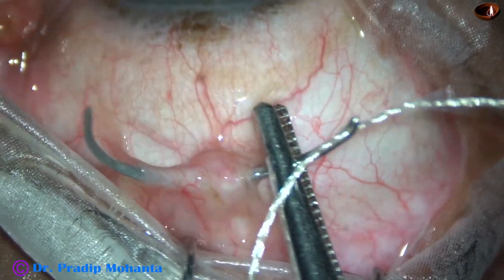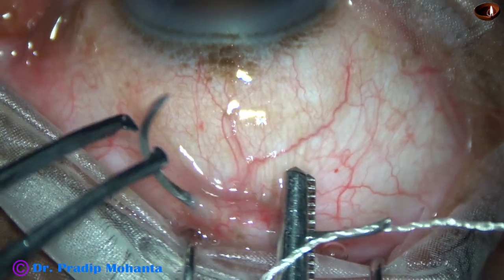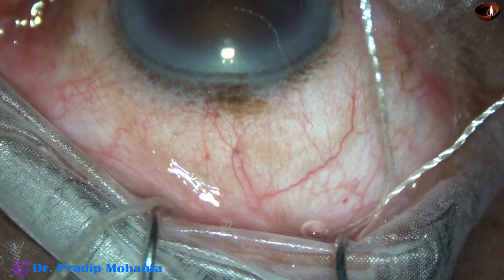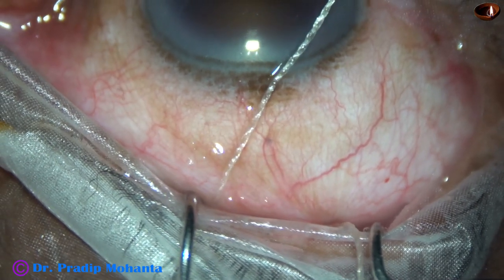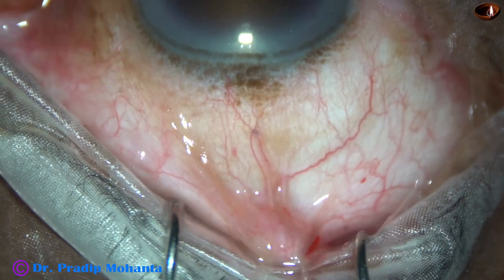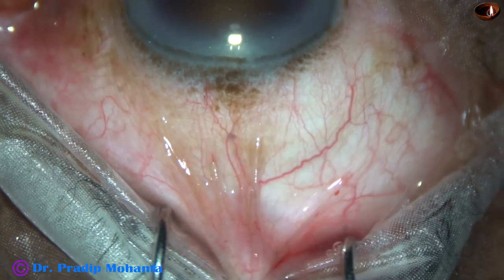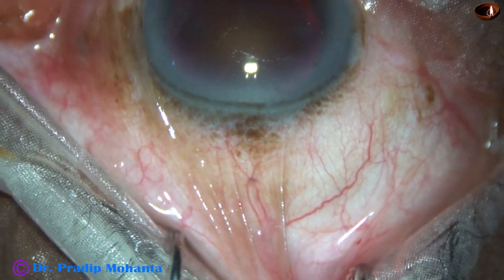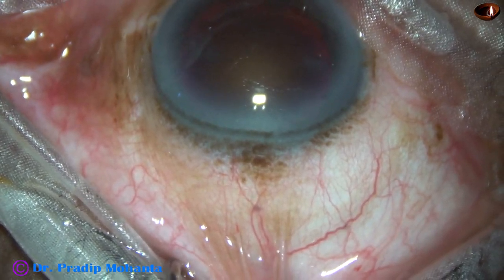This is the Superior Rectus Bridal Suture. I usually turn the eyeball down with the muscle hook, hold the Superior Rectus Tendon with the forceps, and very carefully I pass the suture underneath the Superior Rectus Tendon. And now there is good exposure and we can work very comfortably to make the Sclerocorneal Tunnel.